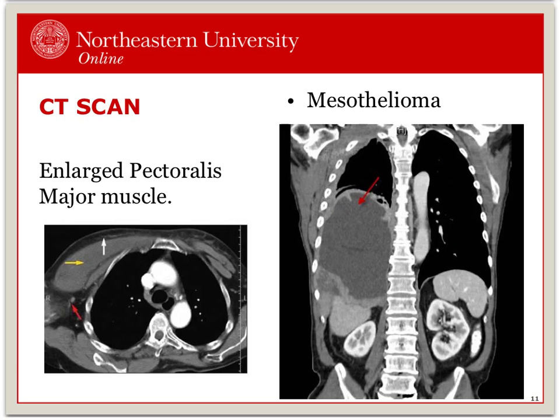Additional studies that include perfusion studies and nuclear medicine can be read about in your text. Nuclear medicine is a medical specialty involving the application of radioactive substances in the diagnosis and treatment of disease. Many images you have seen today come from yale.edu/imaging, which I also highly recommend for further imaging and study examples.